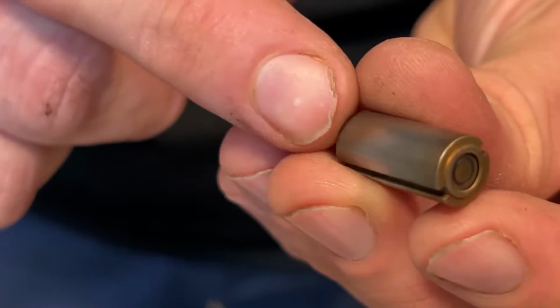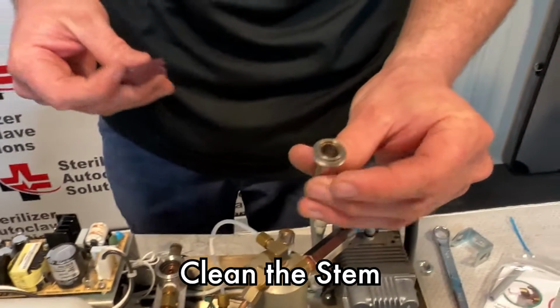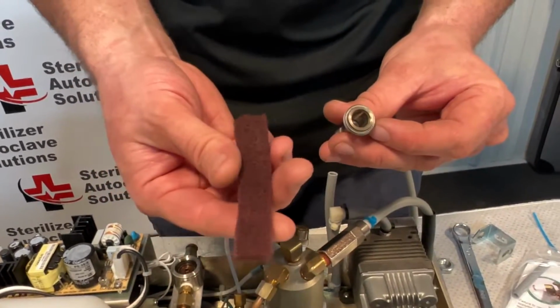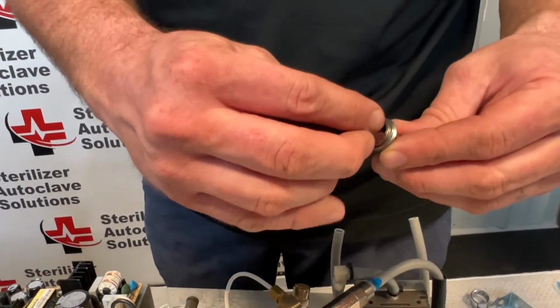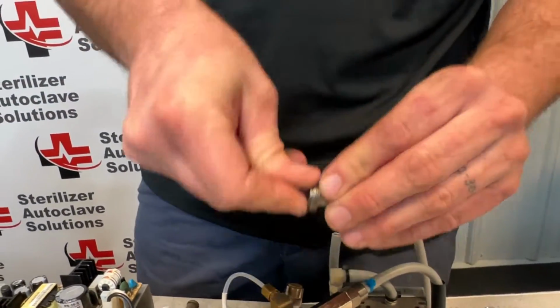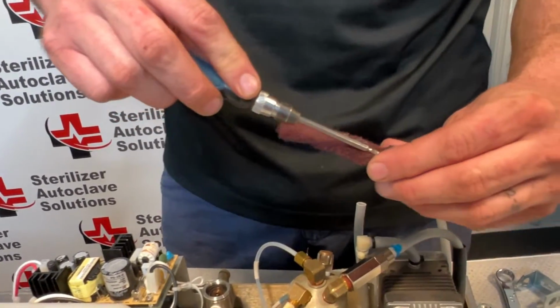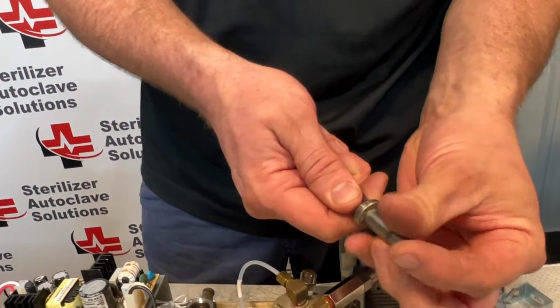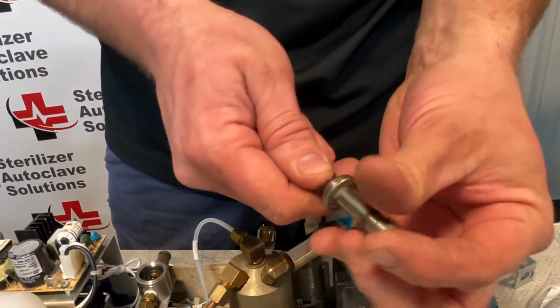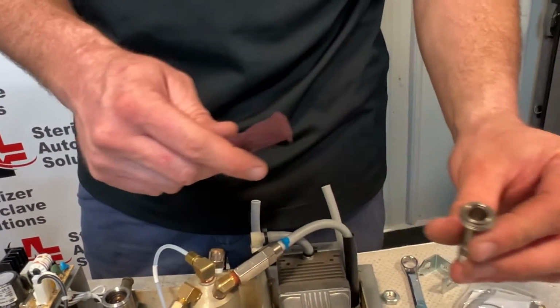You can clean these. To clean the stem, I'm going to use a piece of Scotch-Brite that I have cut down to about 1/2 inch, about 3 inches long, and simply put that in there. Using a flathead screwdriver, just kind of push it in and clean it out. It should be nice and silver on the inside.